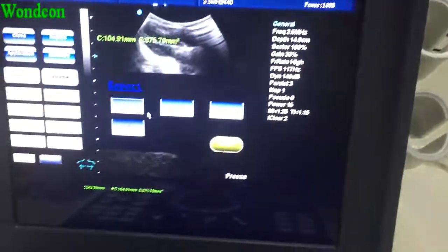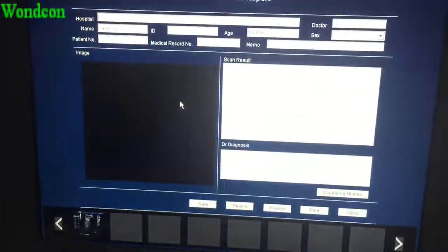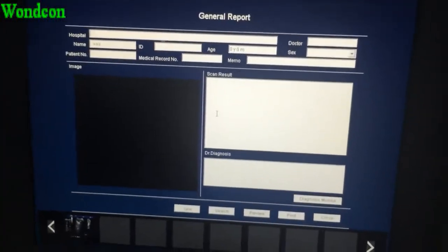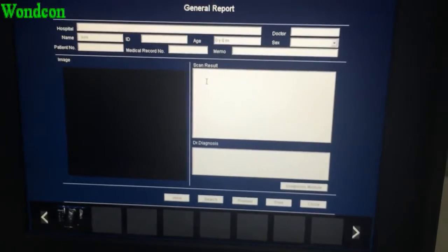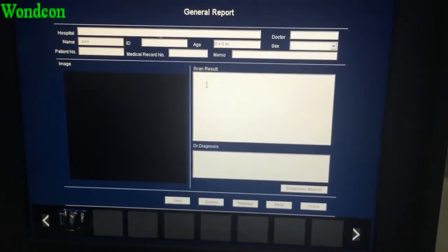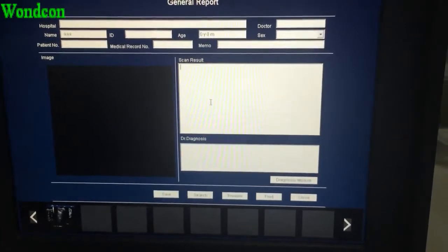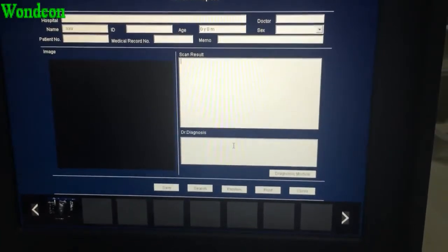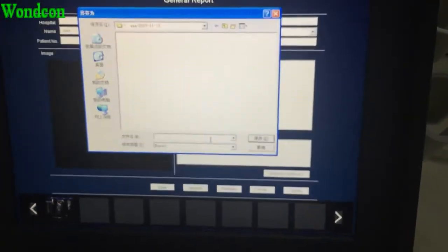Then press the report. Press a comment, then the doctors can write the information of patients here. After that, you can save the report.